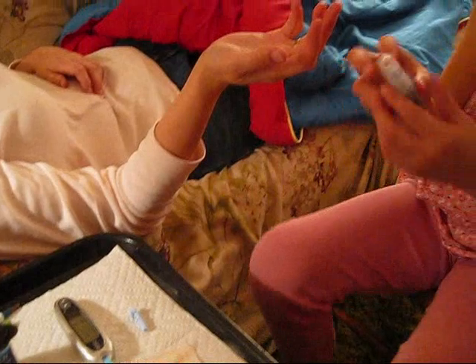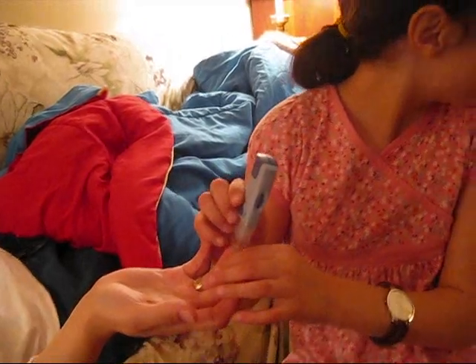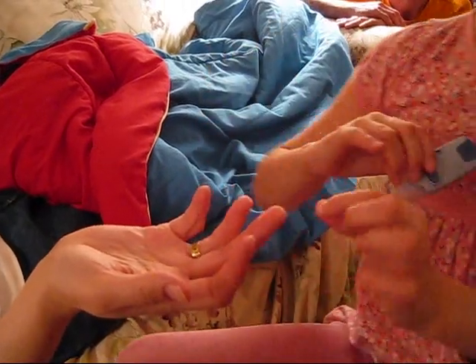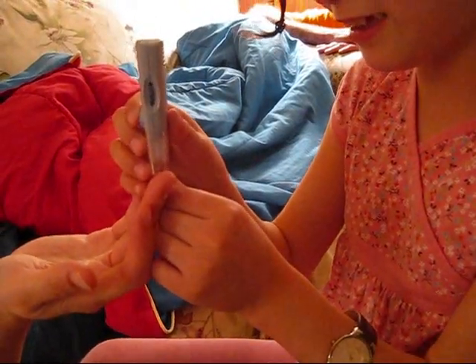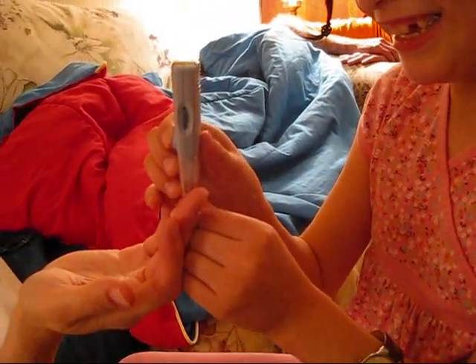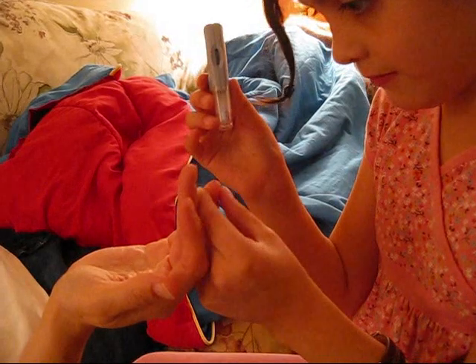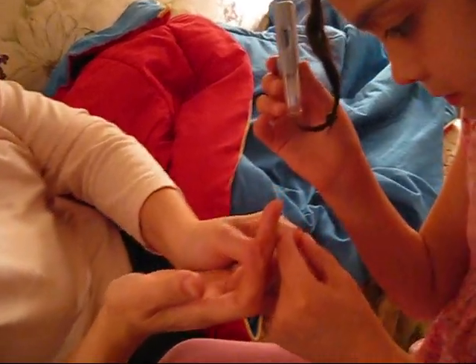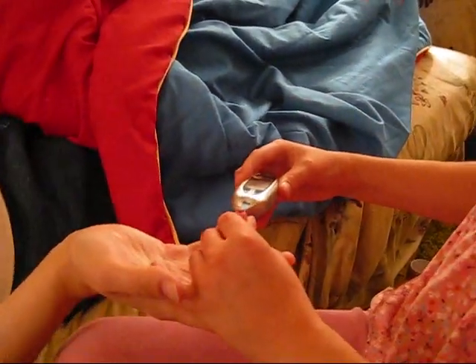Ready for blood. It was this one? Yeah. Pull the needle back. Pull the needle back. On the top or on the bottom? On the top. There we go. There we go. Is that enough? Yes.